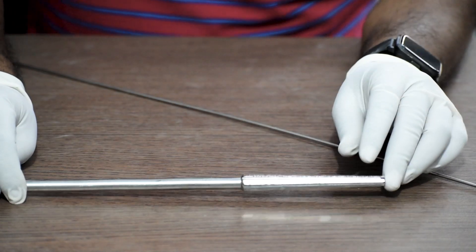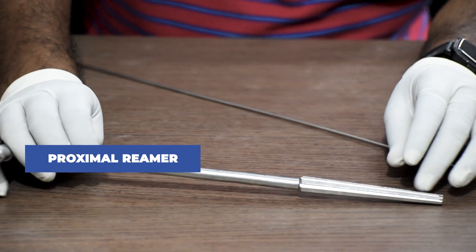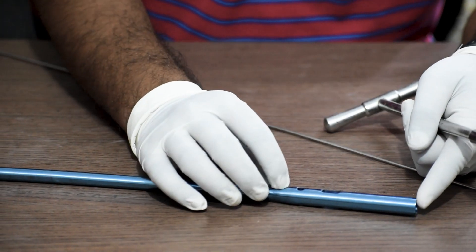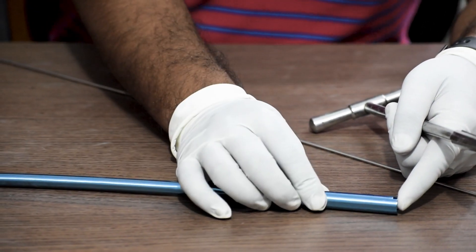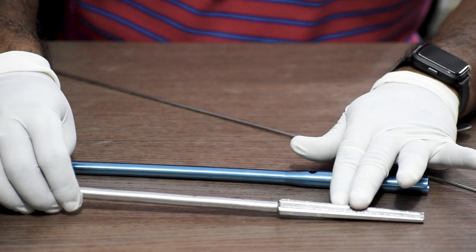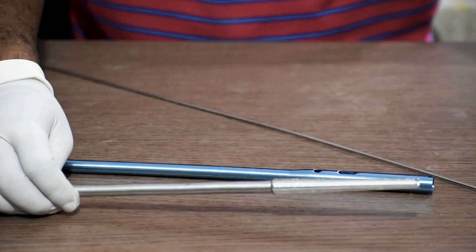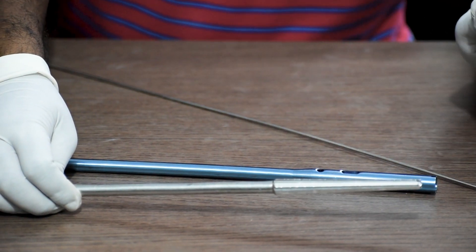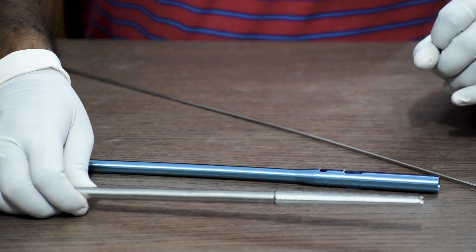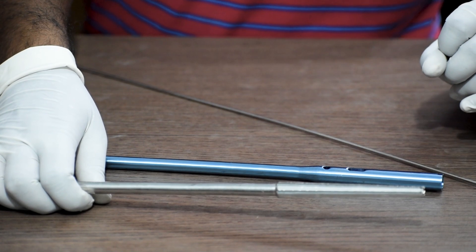Once the reaming is done, we will use a proximal reamer of 13 mm and do the reaming to create a proper entry point for the proximal part of the nail. As you can see, the proximal part — the head region — of the femur nail has a bigger diameter of 13 mm than the distal part. So we use the proximal reamer to ream at the entry point for a proper and smoother entry.